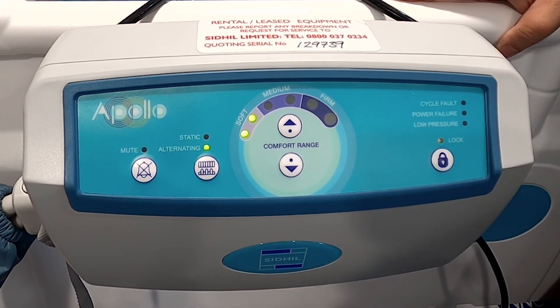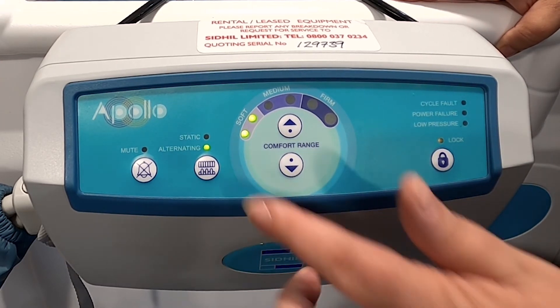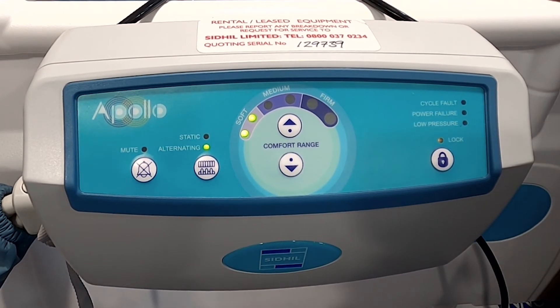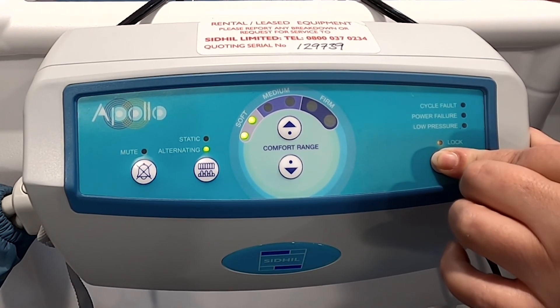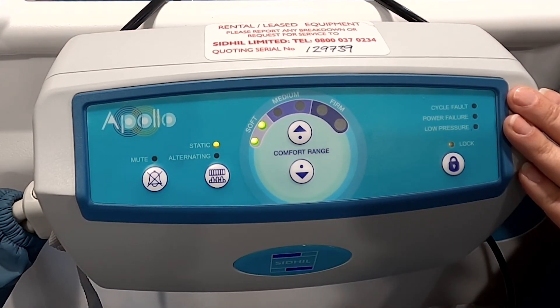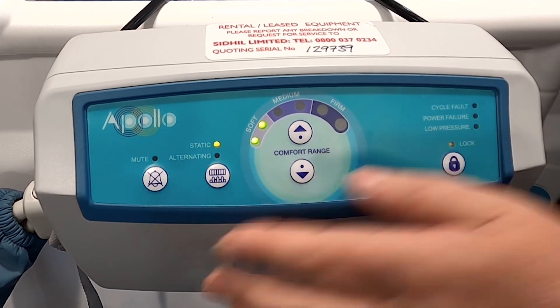Now we're going to look at some of the functions within the mattress, starting with the alternating and static modes. Patients should always be nursed in the alternating mode, which is indicated by the green light that you see here. The static mode may be selected when any nursing procedure is being carried out or for patient mobilisation. When using the static mode, an amber light will illuminate to activate the full inflation of all cells. The system will automatically revert back to alternating mode after 30 minutes — a safety mechanism to ensure patients are not left lying on a constantly hard surface. If static mode is no longer required before the automatic switch, press the button and the mode will revert back to alternating and the green light will illuminate.